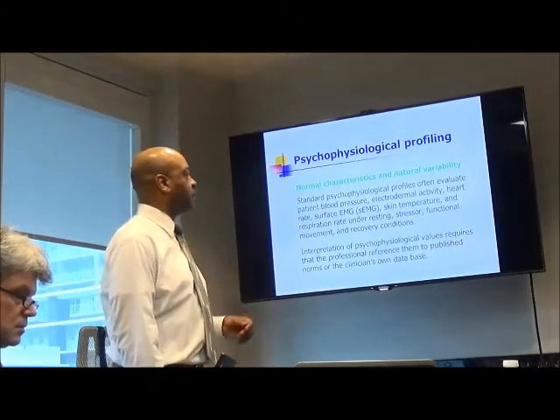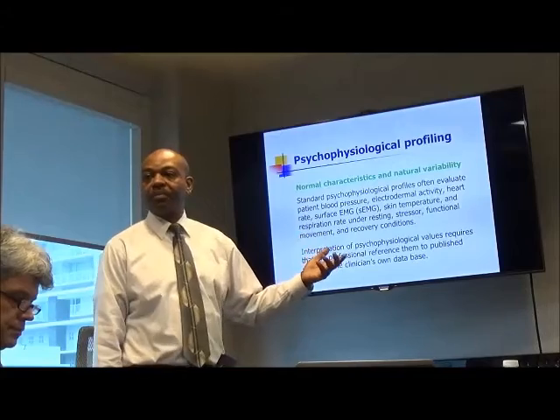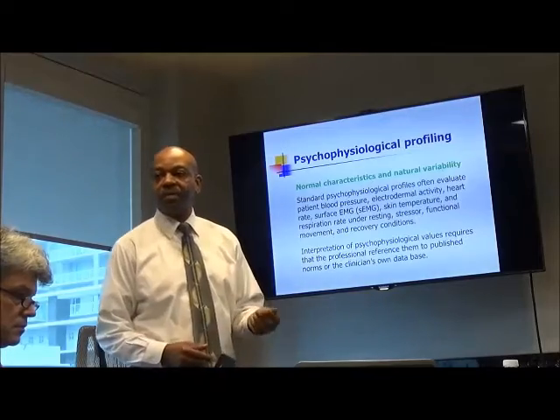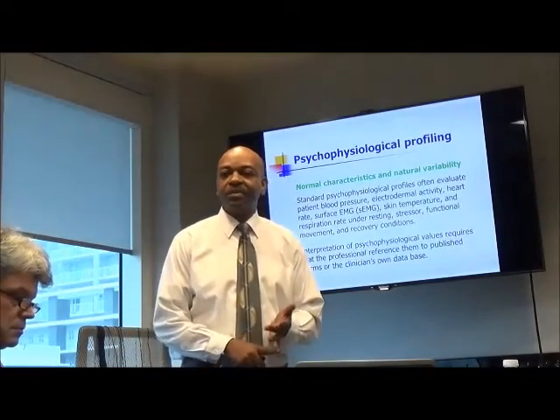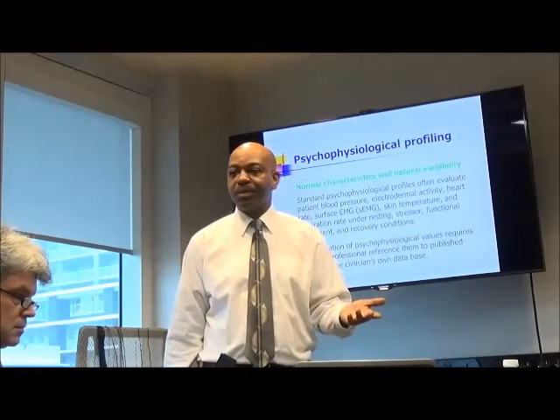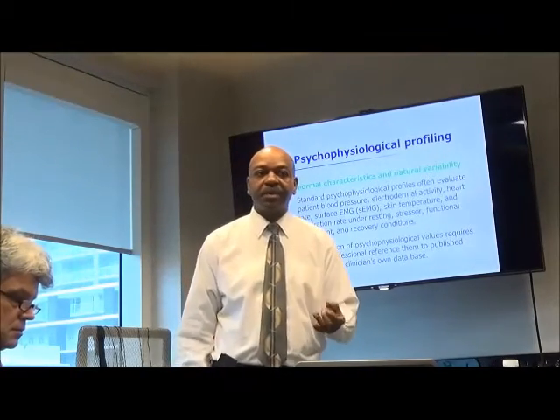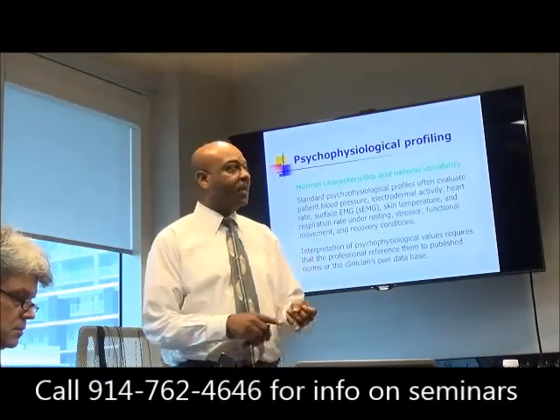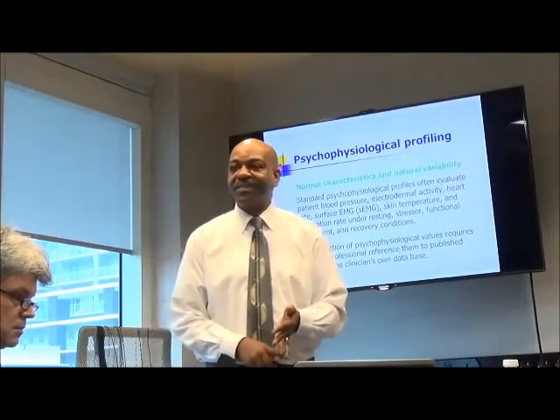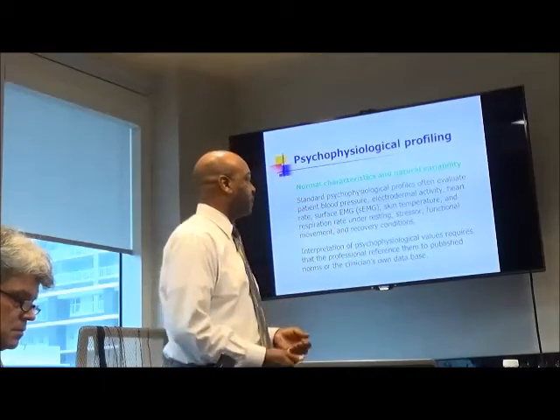So these are some of the things that we might measure. Here they're listing blood pressure. Many times people don't do blood pressure with the stress profile, but you have electrodermal activity, which is referring to sweat. And the funny thing with electrodermal or sweat activity, there are many different terms that are used for very similar things. So for measuring changes in the amount of sweat on the skin, you have electrodermal activity, you have electrodermal response, you have GSR, galvanic skin response, you have skin conductance. All of those terms have to do with the sweat activity.